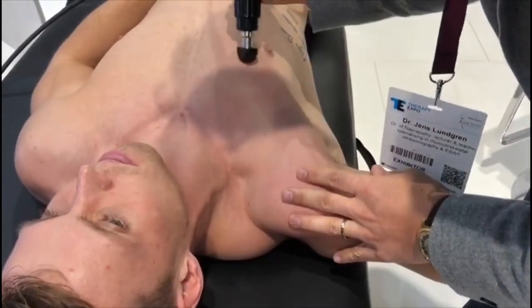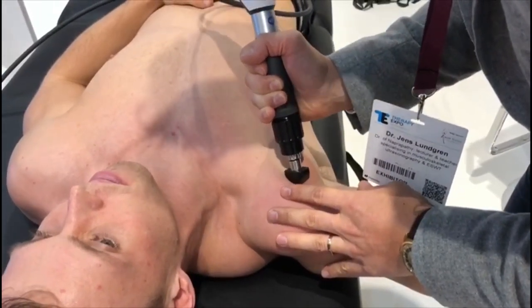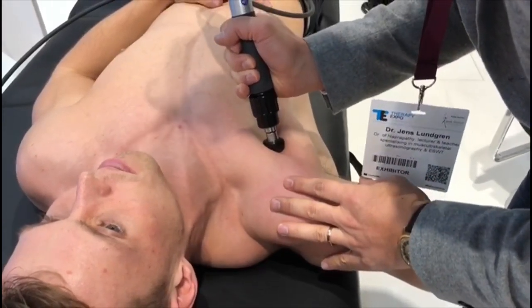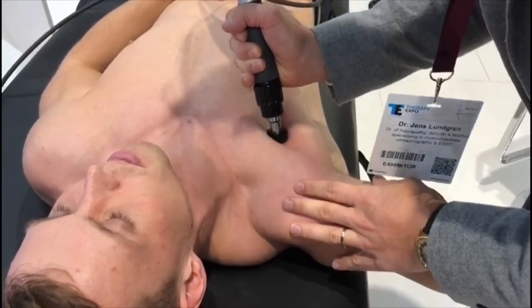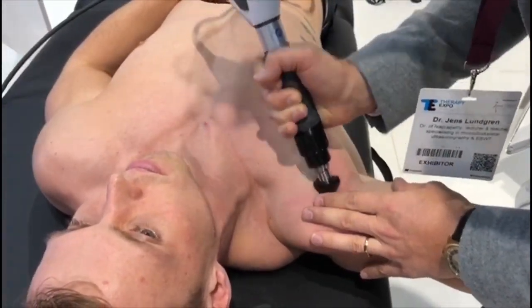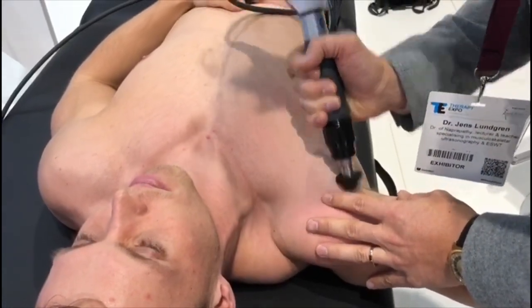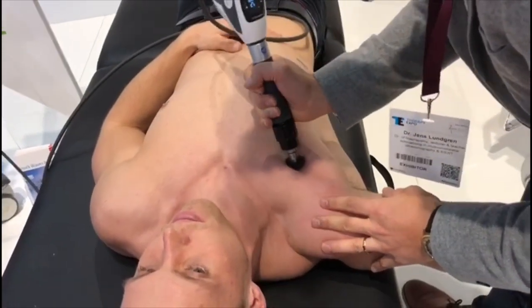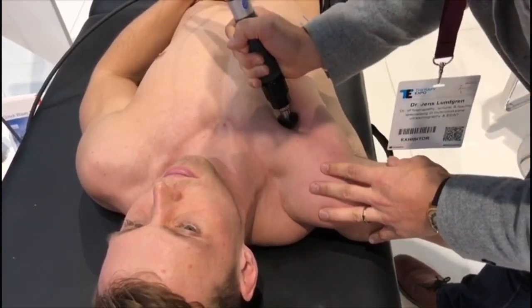This is quite similar to other types of treatments when it comes to fascia release, which is very popular today. The big difference is that I can put my settings in the machine to recreate the same treatment every time. I know that I have a certain pressure, I have a certain frequency, so it's a lot easier to control the treatment, because if I use my fingers, if I'm in a good mood, maybe I will be stronger and put more pressure, and if I'm in a bad mood, maybe or tired, I will do another completely different treatment. But when I use the Shockwave, it's easier to standardize.